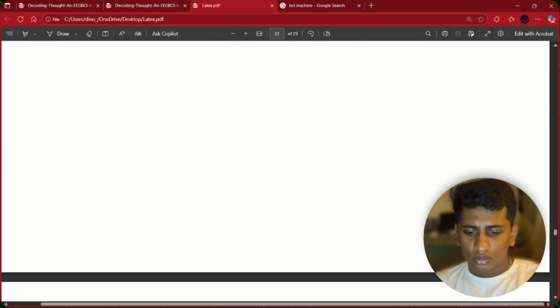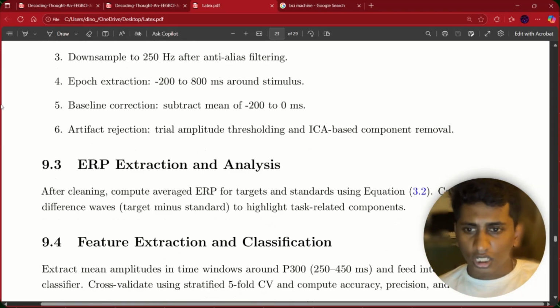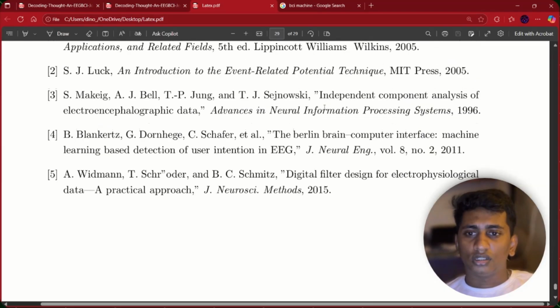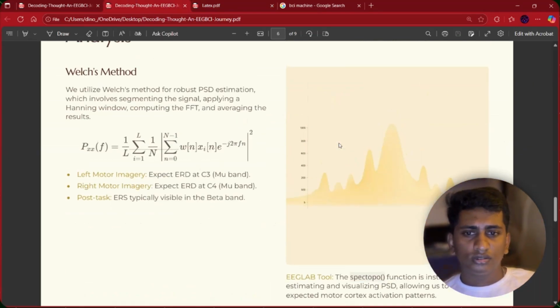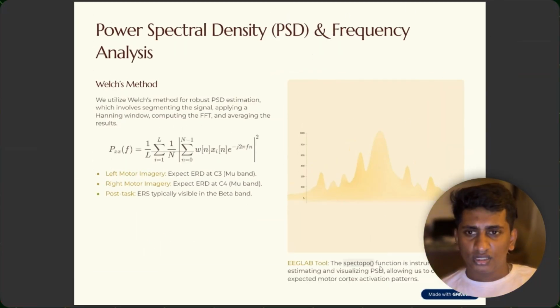So we will close this, and we can go for the demo, and I'll be uploading this so you can read it. We'll close this and we'll start the demo. And yeah, these are a few papers you can refer. And there is a lot of data actually for things you can do. Okay. Coming to again the thing, as now we studied about the power spectral density and frequency analysis, that's the Welch method we are using.